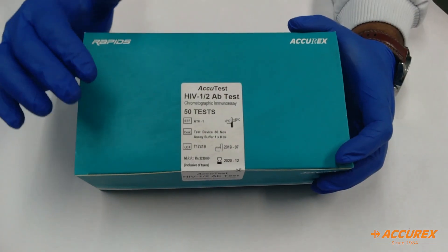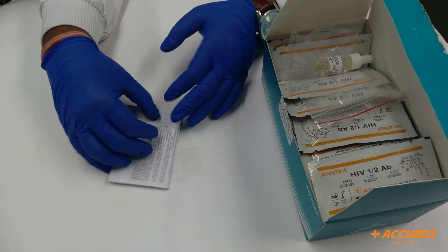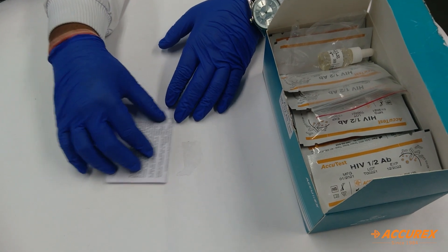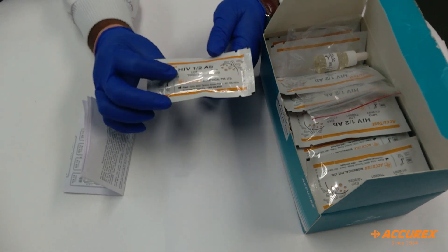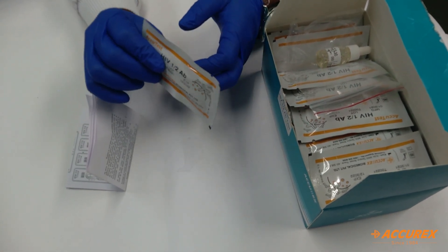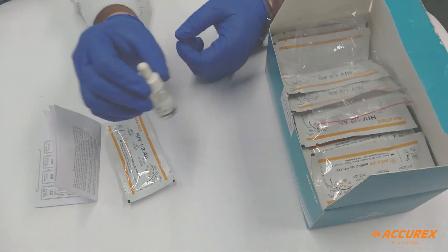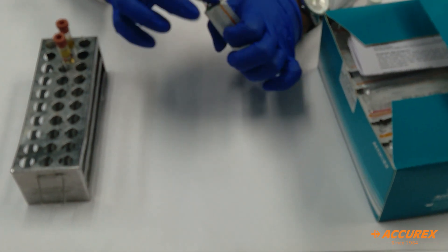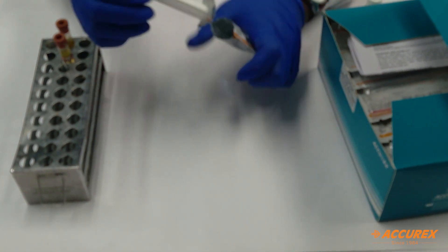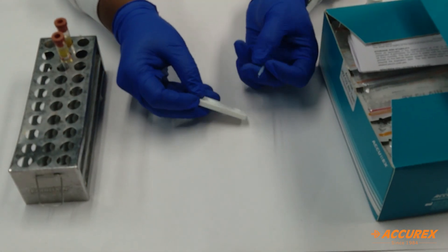Next we will see what components come inside this box. First is a pack insert, which is used to refer to the testing procedure. Then we have a card pouch containing the HIV test card. We also have a buffer, which is used during testing. Inside the pouch, you will find one card and one dropper.